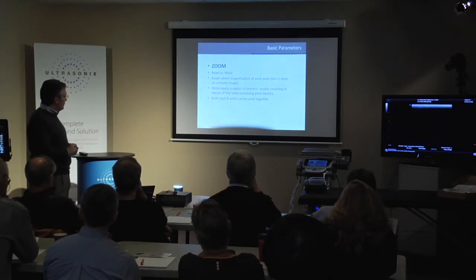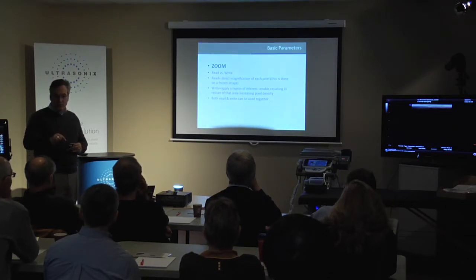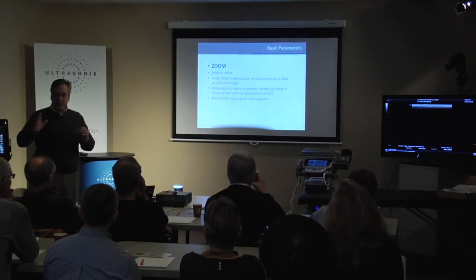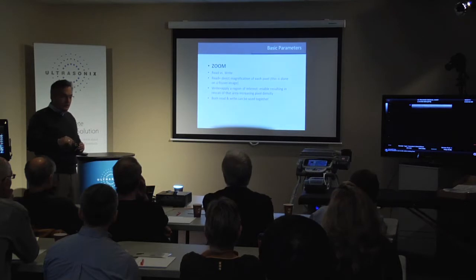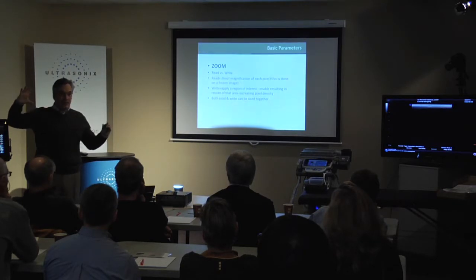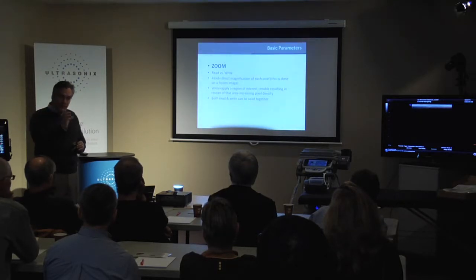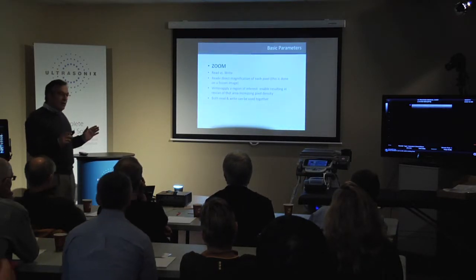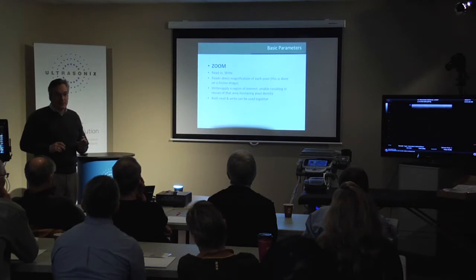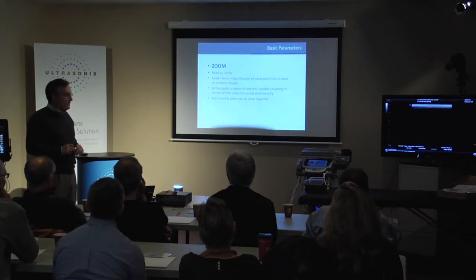The difference with the write zoom is that the HD or high definition zoom feature can be enlisted by touching it, and it comes up with a square, a box, a region of interest. You can actually redefine that region of interest on the screen, shrink it down, make it larger, and when you hit the update key, which will be shared with you on the interface, it takes the information in that box and displays it on the overall image field, giving you a tighter display and resolution for more accurate depiction of a fine area of interest that you may be coning in on. And not to confuse you further, but you can also zoom up that heightened detail of the high definition zoom as well. And we can play with that when we actually have hands-on as well.